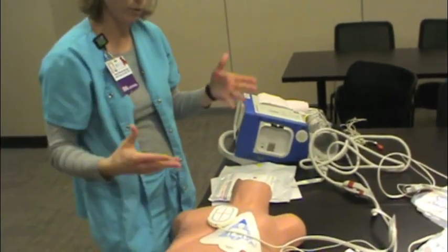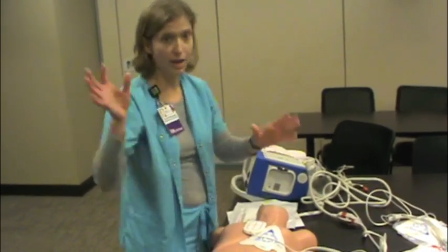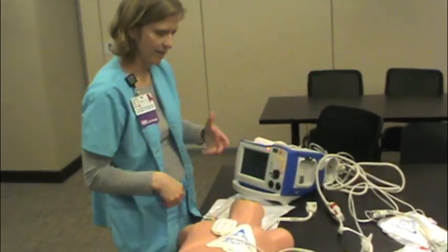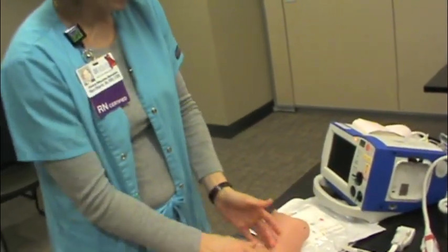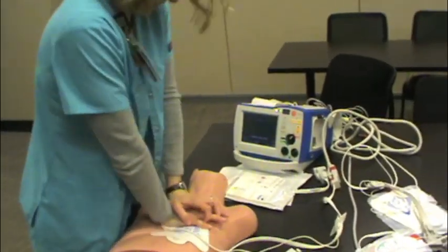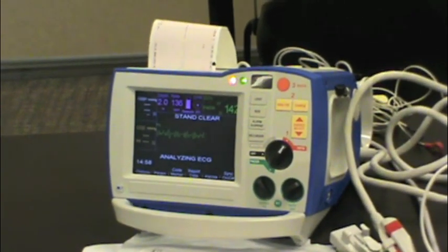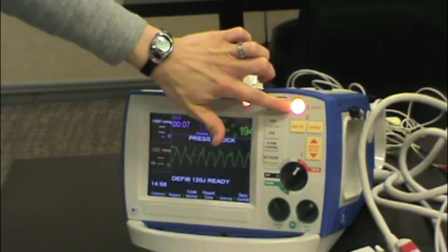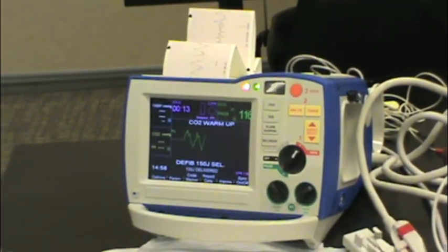Imagine going into your patient's room and all of a sudden his eyes roll back and he goes unresponsive. You call a code and start chest compressions while you wait for the defib. As soon as the defibrillator arrives, hopefully you'll have a buddy to help put on the pads appropriately. Continue CPR while you turn the monitor on and flip it right to defib. As soon as it's on, hit Analyze — analyze tells you to stand clear. The button lights up telling you to shock. Clear the patient, deliver the shock, and get right back on the chest.